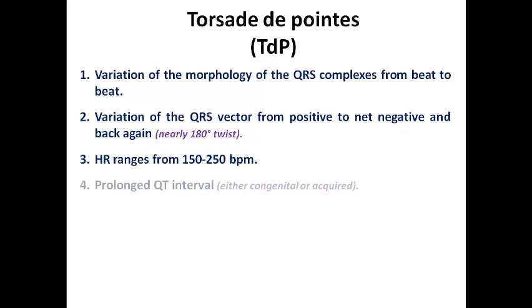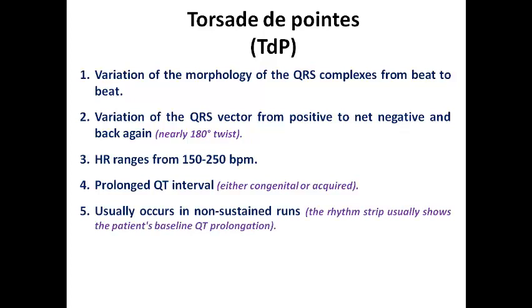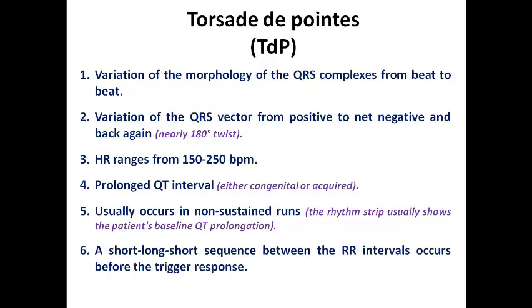Also we can see evidence of prolonged QT interval in the sinus rhythm preceding or following the non-sustained VT, either due to congenital long QT syndrome or acquired causes such as iatrogenic, hypokalemia, hypocalcemia, or subarachnoid hemorrhage. TdP usually occurs in non-sustained runs, and the rhythm strip shows baseline QT prolongation. A short-long-short RR interval sequence is also seen, where an impulse falls in the relative refractory period, predisposing to Torsade de Pointe and then ventricular fibrillation.